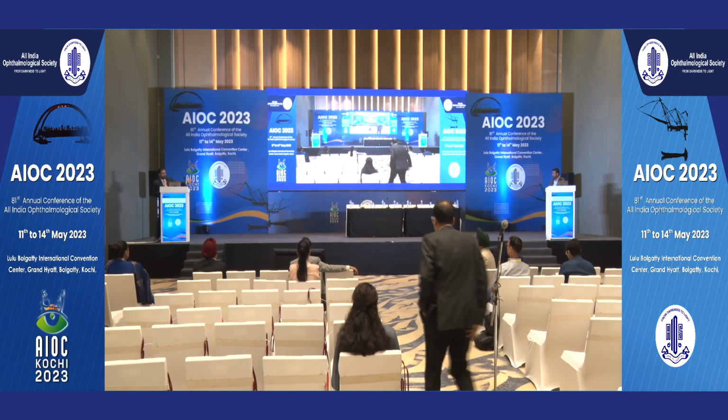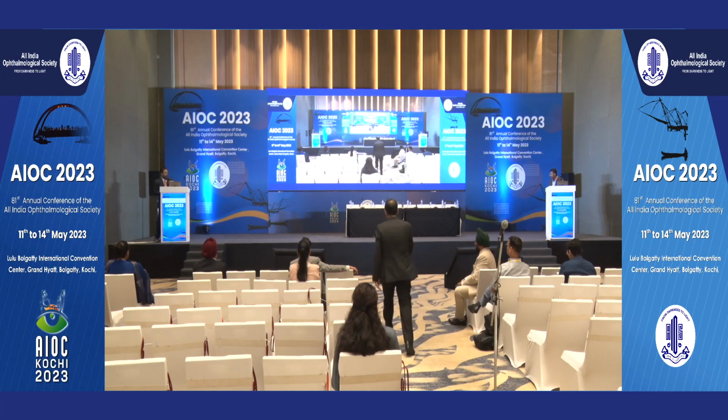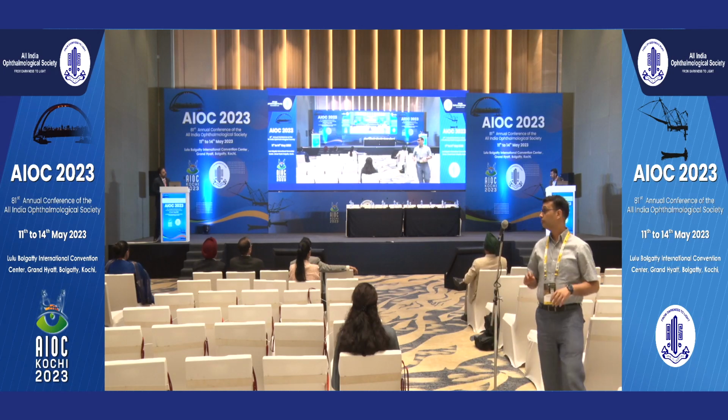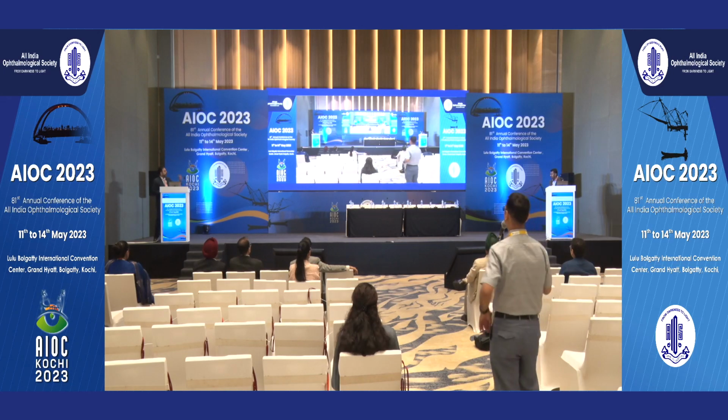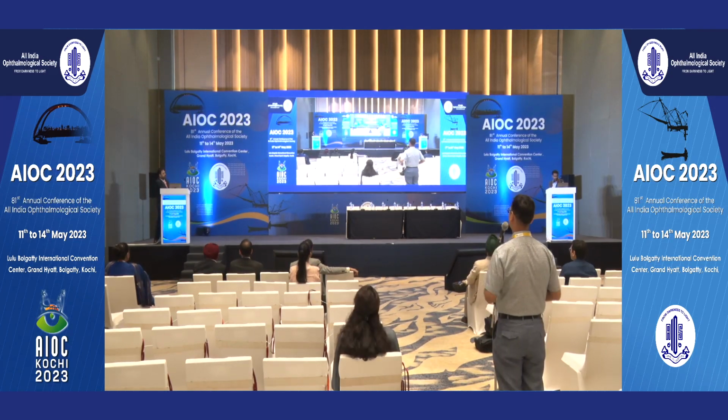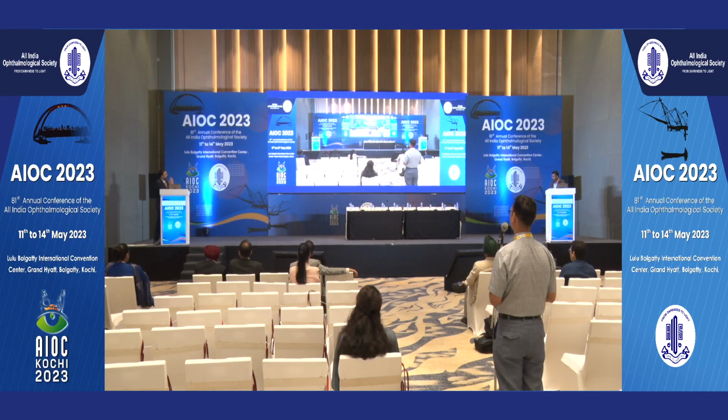Again, Basaf, just one last question regarding this to you, and then we come on to the retinal fold thing. Given that you had one macular hole in one of the cases, and then you went on to do 8, 9 others and did not have any, what would be your 2 or 3 pointers that you would say, if this is the size or extent, you should do it or not do it?